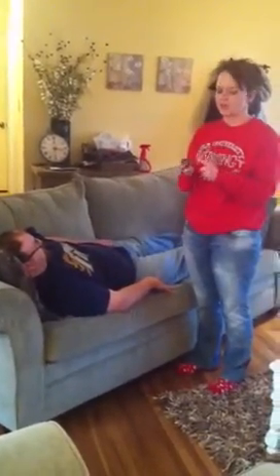So I have my stethoscope here, and you would listen with the diaphragm of the stethoscope, and you're going to start down in the right lower quadrant, and you're going to go around and listen to each quadrant, listening for his bowel sounds, if they're hyper or hypoactive, or if they're absent. But Justin has good bowel sounds. Okay, and then you're going to flip your stethoscope around and listen with the bell of your stethoscope.